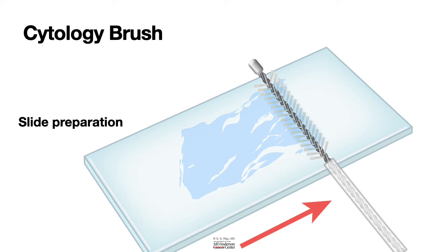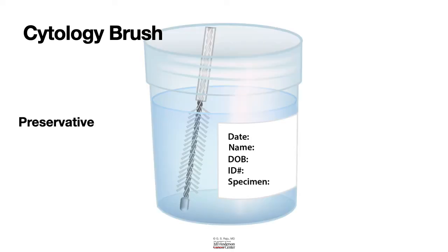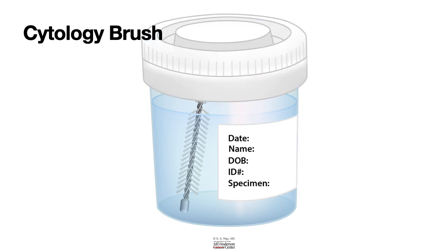In addition, the brush tip is cut and the brush is deposited into a container with a preservative, and then this is also sent to the pathology lab. And the lab takes the brush and prepares the specimens for the pathologist.